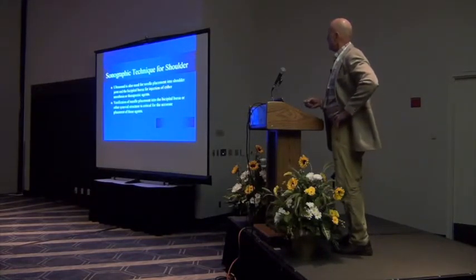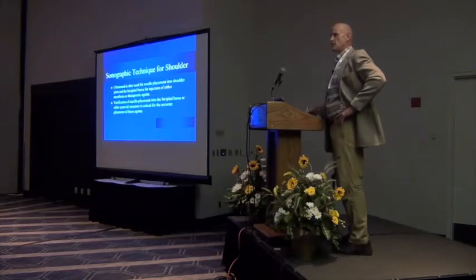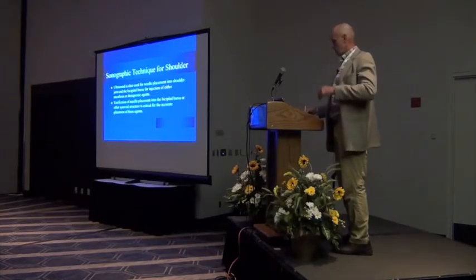But anyway, I like it to also document that I've got the needle where it needs to be, and you can see it as you inject.